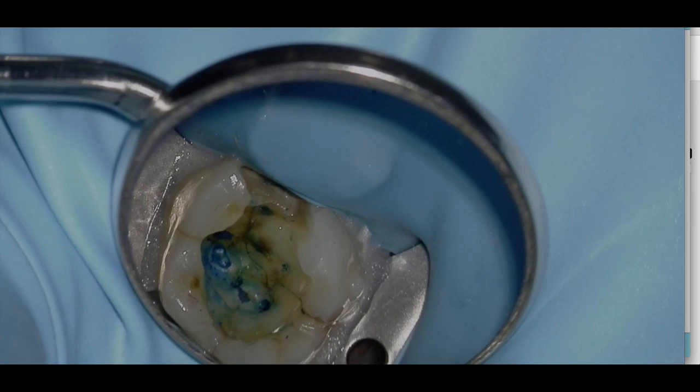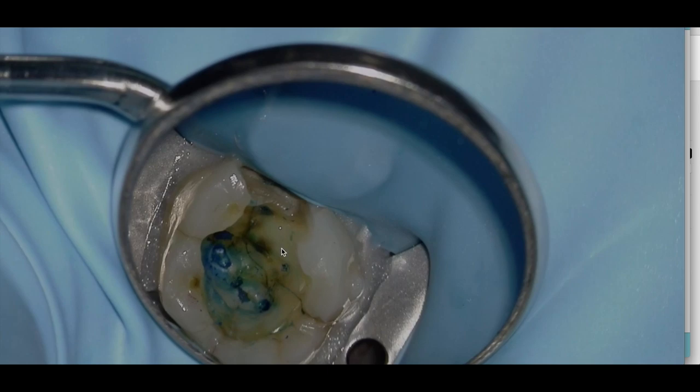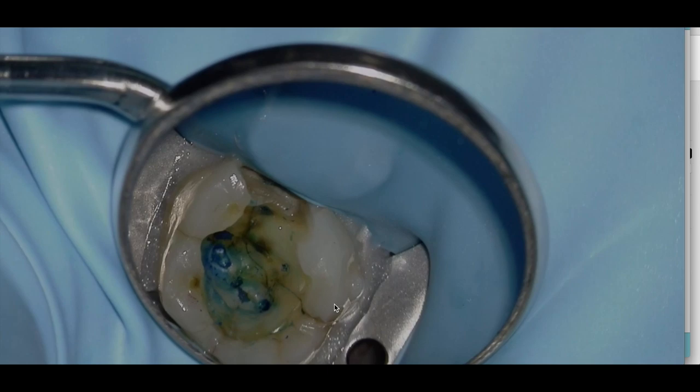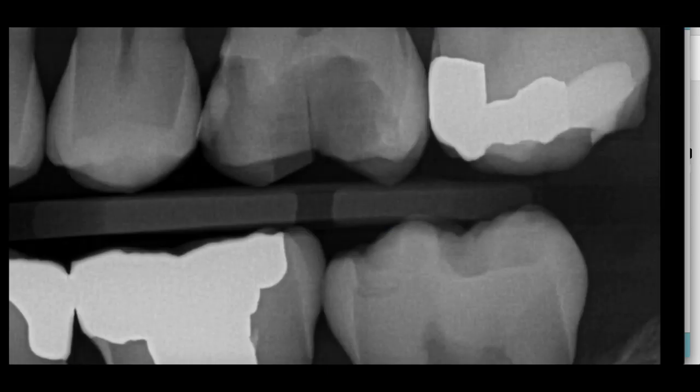All right, let's take a look at this cracked tooth, and let's talk about accessing into a maxillary molar, and let's use this really neat case. Let's take a look at the radiograph.